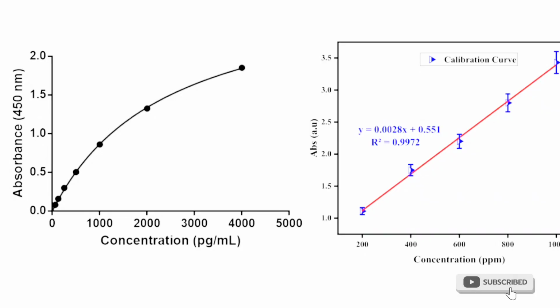But if you get an absorbance of 2.5 or 2.2, it cannot, because once the analyzer takes that 2 point something, there's no 2 point something here. It's just 2.0. So the analyzer will be unable to give you a concentration that is proportional to that 2.2 or 2.5, because the highest sensitivity, or the highest comfort zone, of this analyzer is 2.0 absorbance.